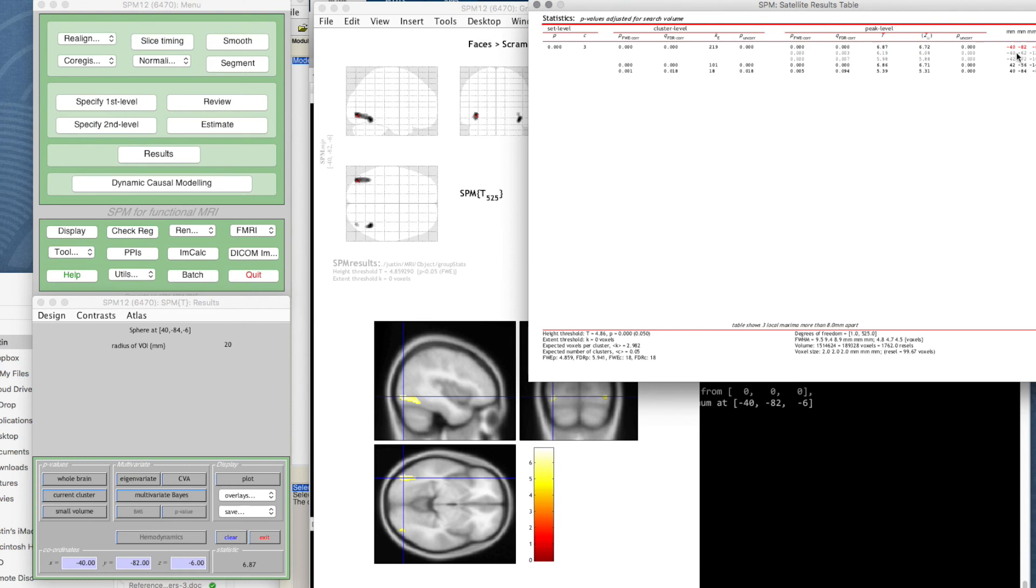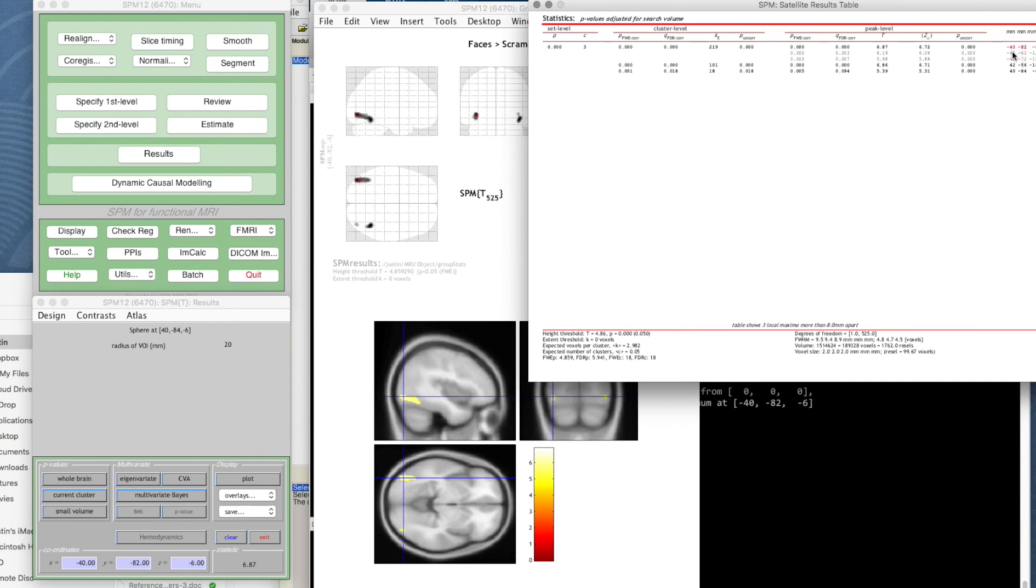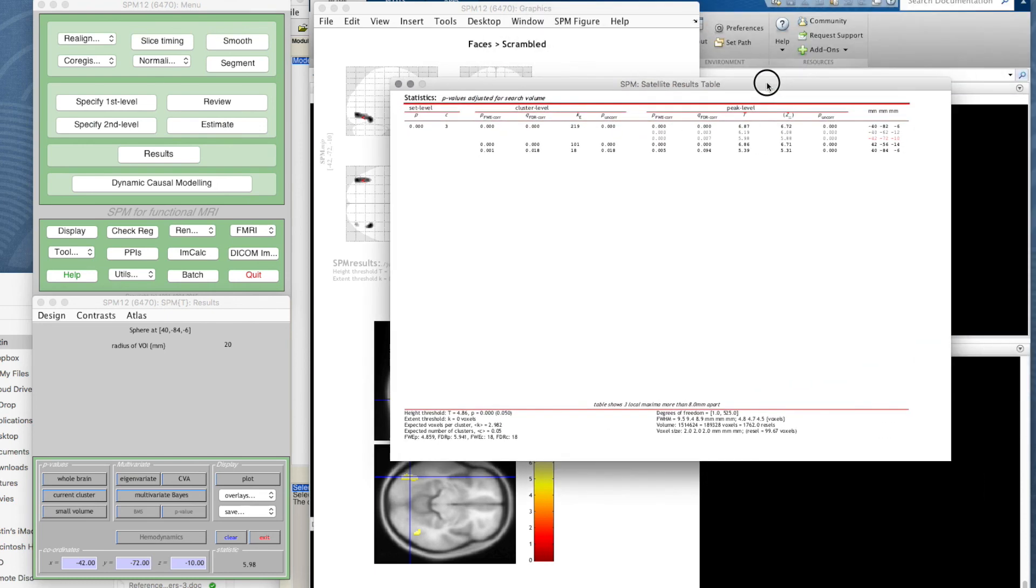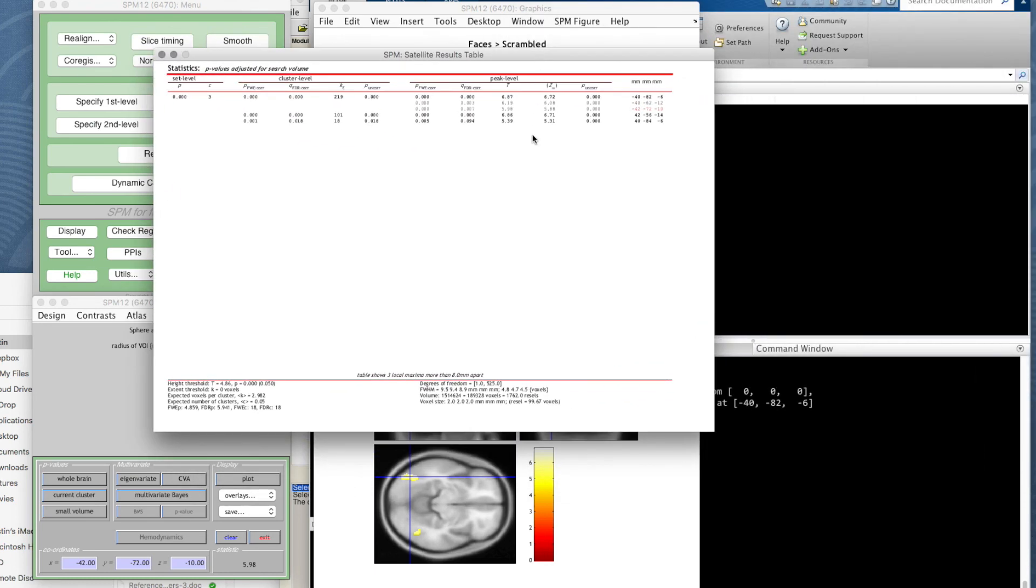One thing to note is that we have this large cluster on the left, and a few millimeters away from the peak voxel in that cluster, we have a couple of other voxels. It's very misleading when you've got the average of a few people's data to think that you've got one large region. These could be the peaks for different people. We don't know yet if we've got good data from all participants—all we know is this is the average.